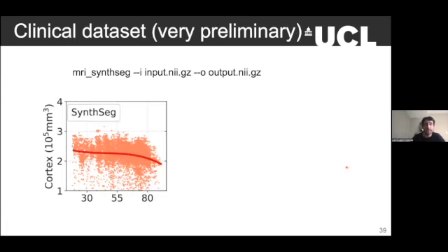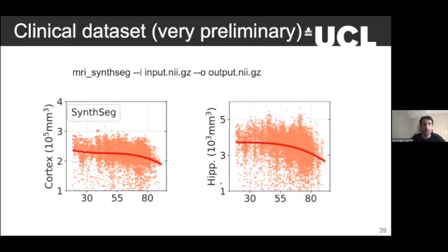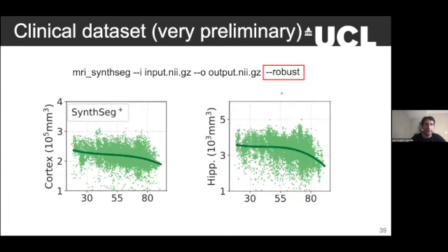Like I said earlier, this is very easy to use: FreeSurfer, mri_synthseg, -i input, -o output. So I encourage you to try. We got pretty aging curves like this using this data in the wild from the PACS. This is the cortical volume. This is the hippocampal volume. You get a progressive nonlinear decline. And this is what you get.